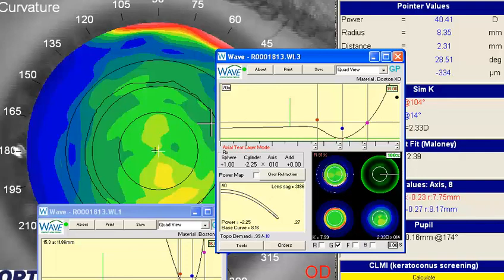With that said, if you make those adjustments, again, for the power, try not to average the astigmatism. Maybe consider a known spherical lens and get a good overrefraction, incorporate that data. My guess is you've got some rotational issues going on with that cylinder, and if we can get that cornea more truly represented on the topography that's brought into Wave, I think you'll be much more successful with that.